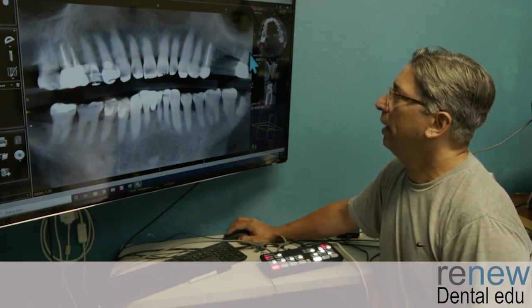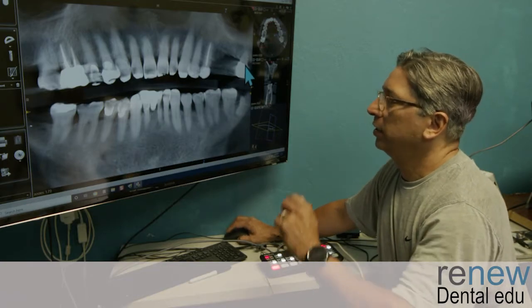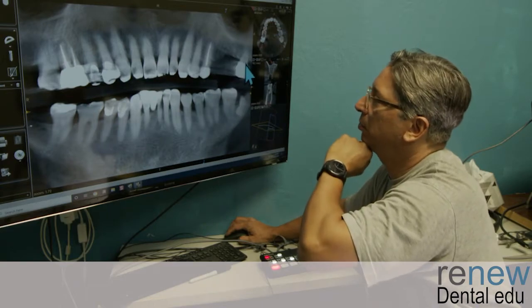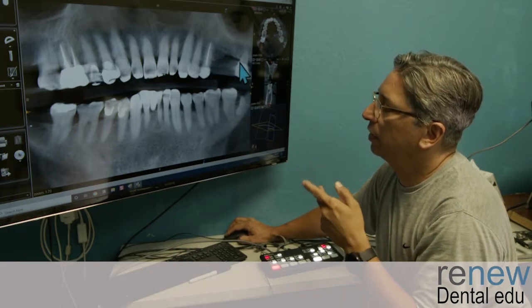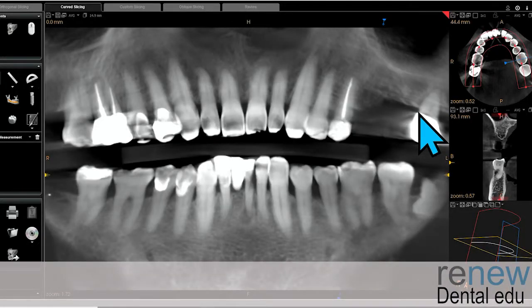Maybe that's enough. We have this wisdom tooth here, and the reason why I want to bring that up is because this wisdom tooth in particular has actually pretty good bone around it. So I was first looking at it going, wow, there's this big defect going on here. And actually the defect is not that big because the area here is very similar bone here and not a lot of bone recession here either. So the bone naturally would progress probably anyway with teeth there, probably from about here to here. So maybe there's a defect around that second molar side, maybe they had a little vertical bone loss like over here that was going on around that second molar. But overall, that's not too bad.